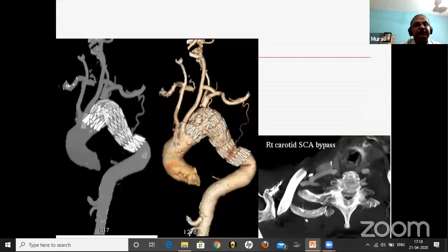And we did a check CT. It was possibly perfect, but in the cath lab, we were not sure where we were going to land the graft. So when you have a doubt like that, it's always better to plan a chimney and keep things ready. That's why this brachial access, you can see here, from the subclavian we went into the carotid, came through and placed this graft, and this aneurysm was treated by this procedure.